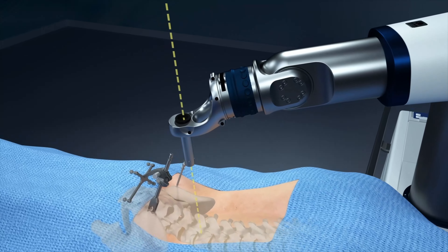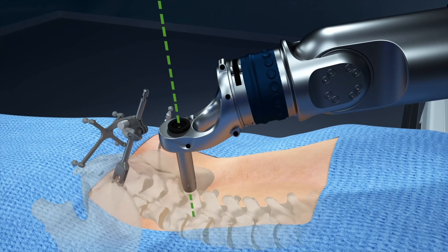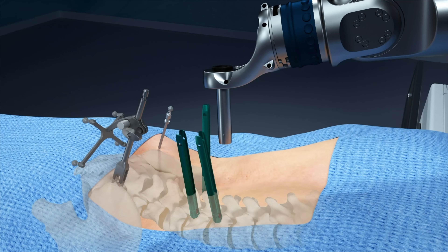Once the arm is moved into the planned trajectory, it travels down the appropriate height for the instruments that were verified earlier in the case. Instruments are passed through the end effector's guide tube, allowing for more accurate screw placement. The arm is then moved to the next screw trajectory until all screws are placed.